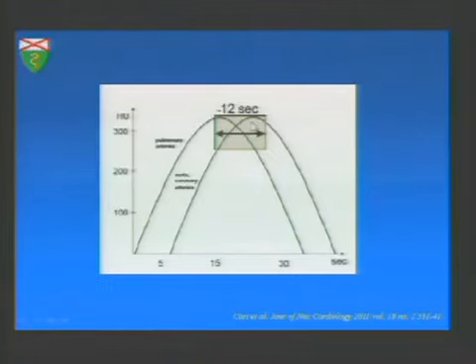After the moment you start scanning, you still have about 15 seconds to scan the patient. So you need to keep the pulmonary artery opacified for 12 seconds plus 15 seconds. So it's almost a 30-second bolus time. Okay?